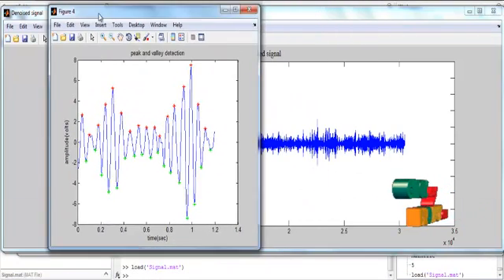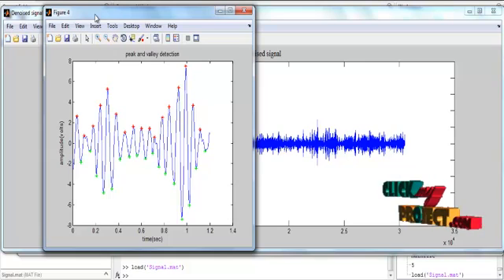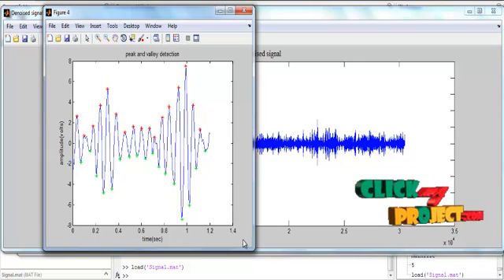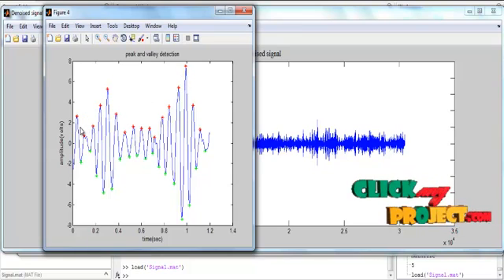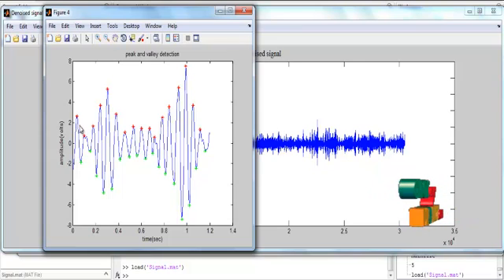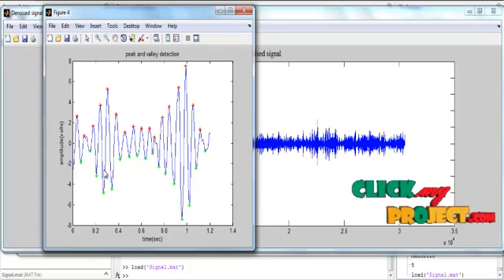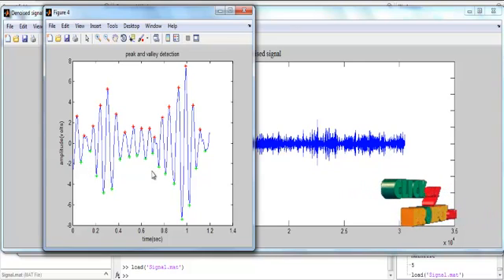Now we can change the range limitation to 0 to 1.4, and the peaks are detected according to the peak values. Here we have peak and valley detection. The red color points represent the peak values, and the green color points represent the valley points.